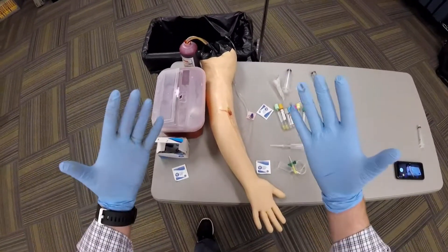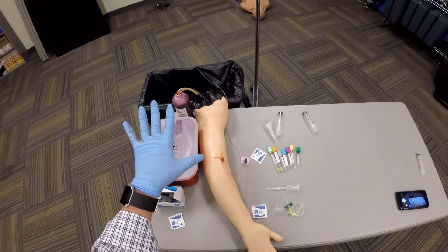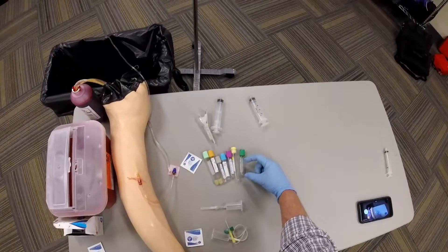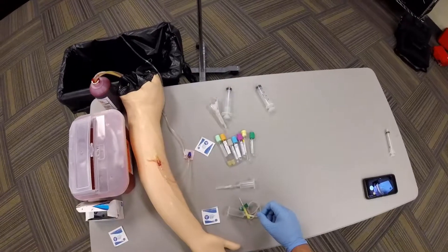Obtaining a blood sample. BSI, explain the procedure to your patient. Verify that you know the correct order of the colors as well as the amount of blood needed for each test tube.